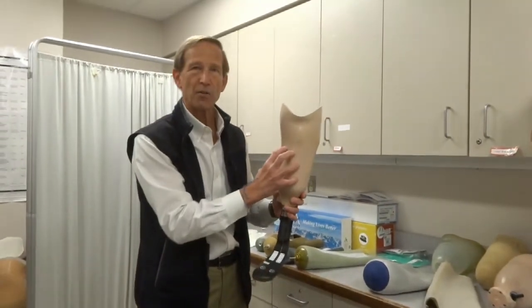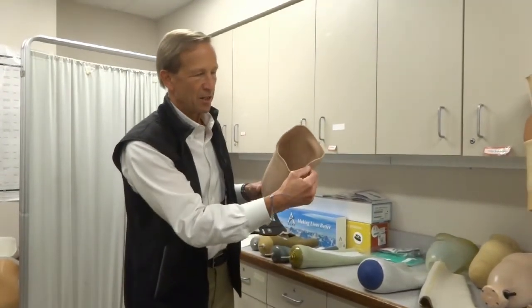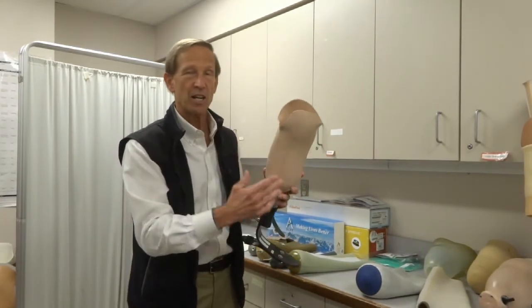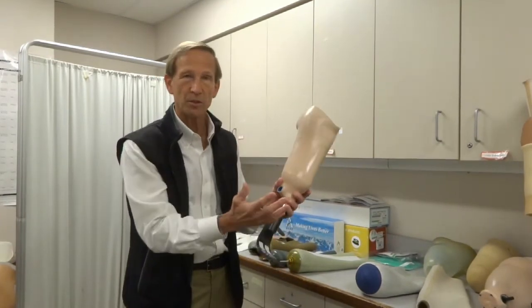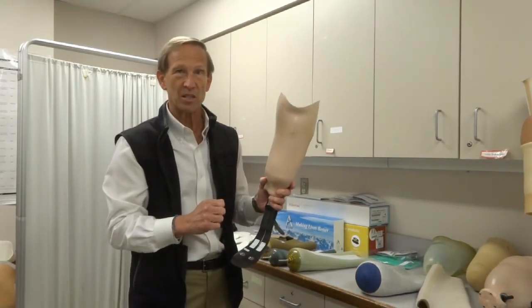This outer frame of the socket is typically called a laminated socket. There's a dark line here because this is carbon fiber lamination — layers and layers of carbon fiber put over the mold of your leg. That then creates a very strong, very hard, but very light prosthesis.